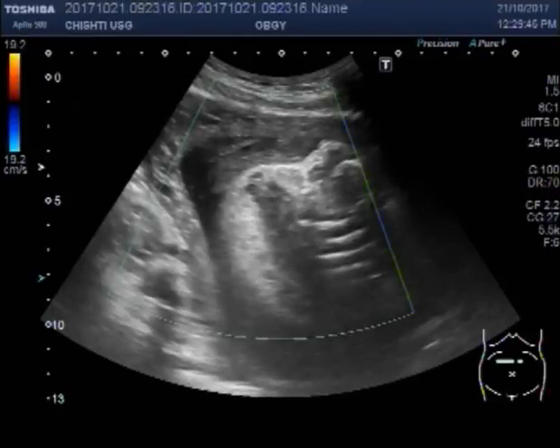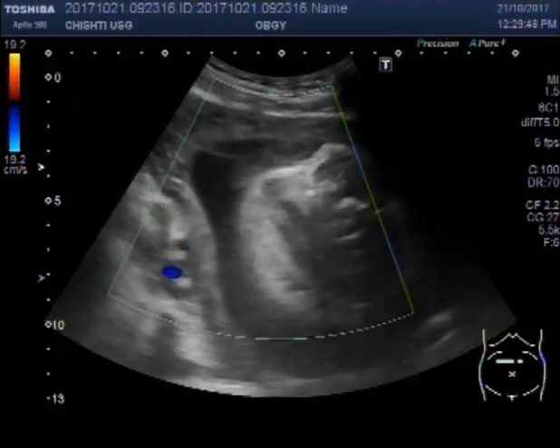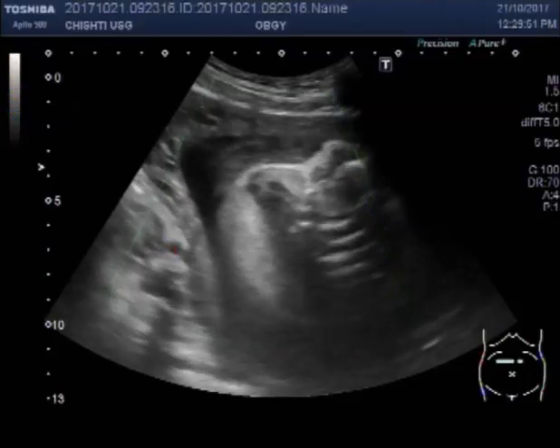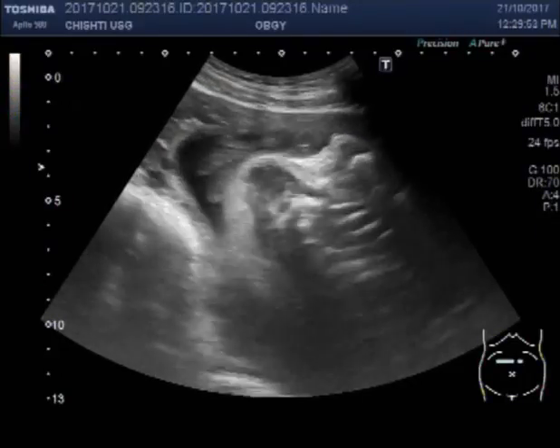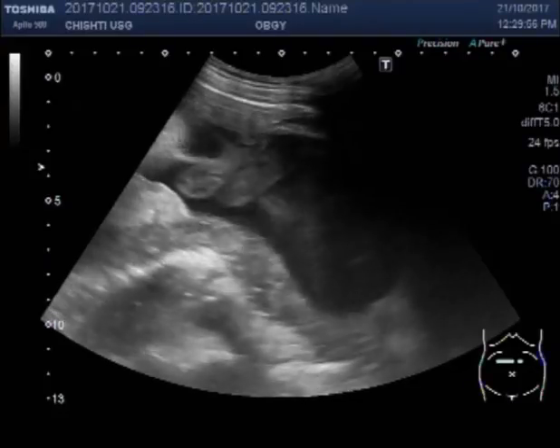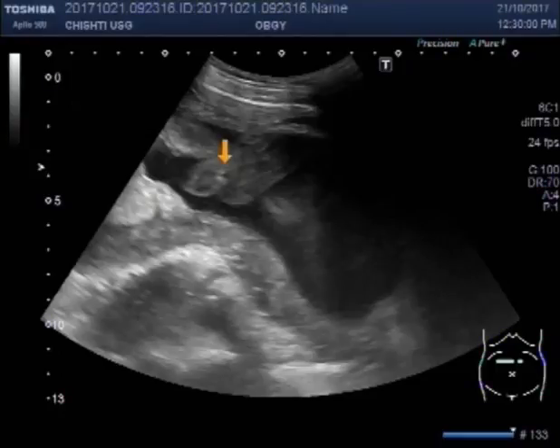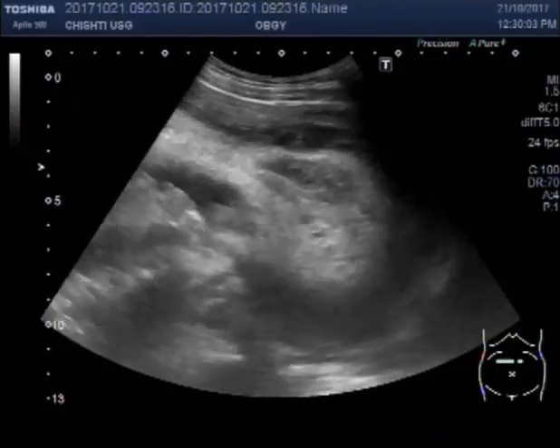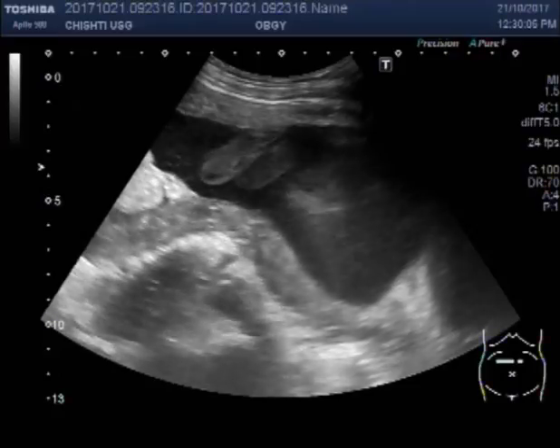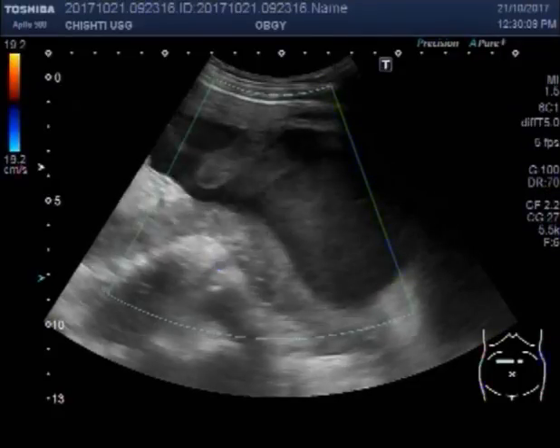Now you can see there is no blood flow in the umbilical cord. This is the umbilical cord — no blood flow is seen in it due to the death of the fetus. No cardiac activity is seen. Spalding sign is positive.